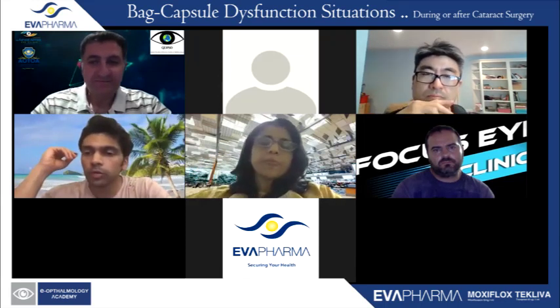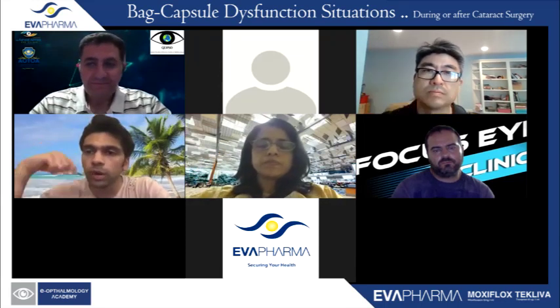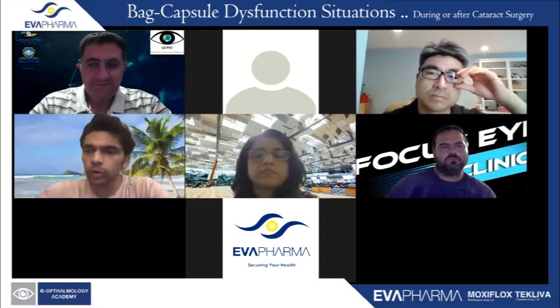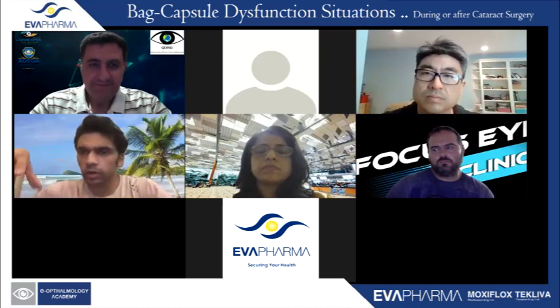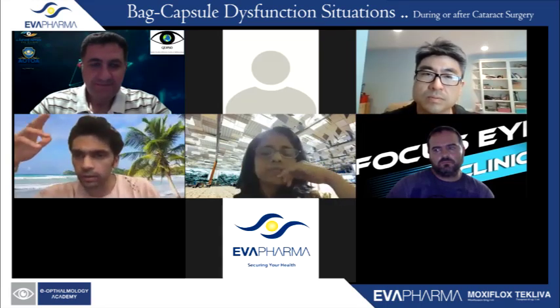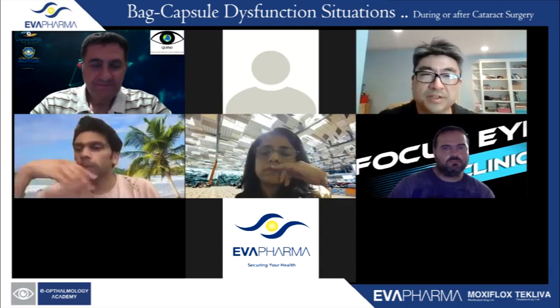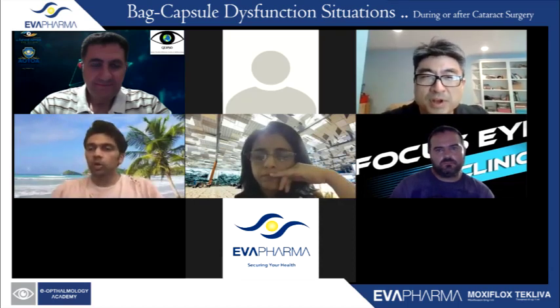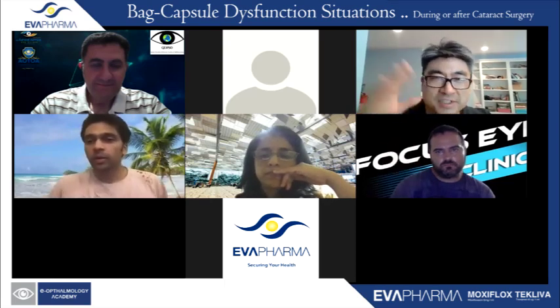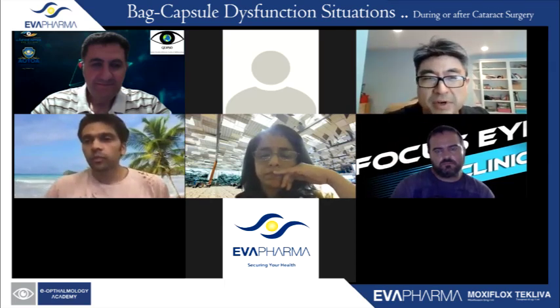Brian, one question to you. Like how you can actually lift the IOL and glue it in place, the same intraocular lens, could that be possible in Yamani, and have you done that? No, you guys are 100 leagues ahead of me. I don't do this infusion, go inside the back of the eye. I don't have that experience.